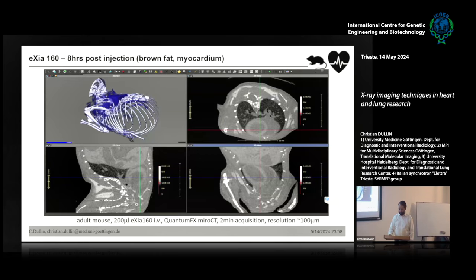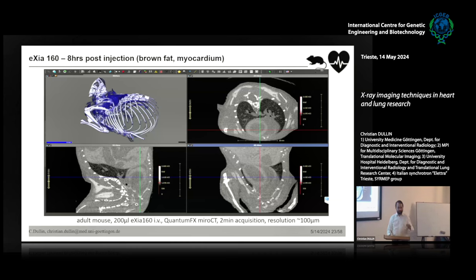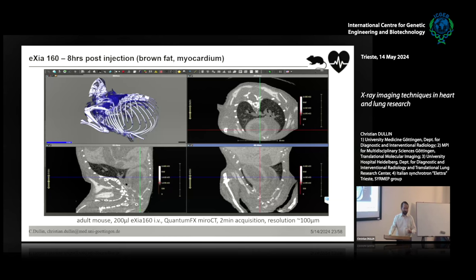The interesting part: if you leave the mouse alone for four to six hours, this contrast agent gets metabolized by the myocardium and brown fat, giving a reverse contrast — you can now see contrast in the myocardium. Parts where myocardial metabolism is not working, like in a stroke or heart attack model, don't take up contrast. So you have a good way of seeing the size of the stroke-affected area in vivo.